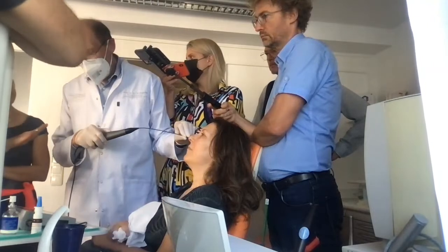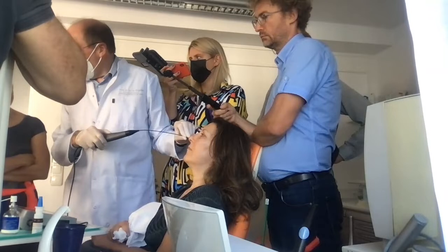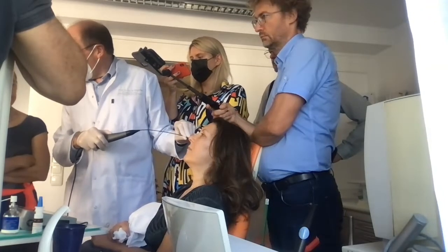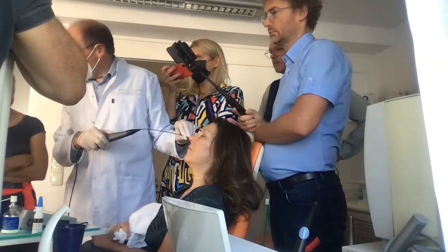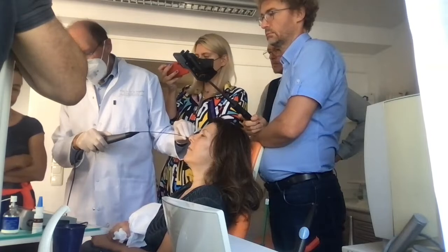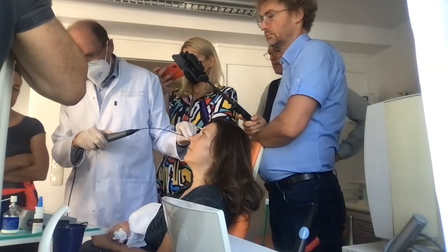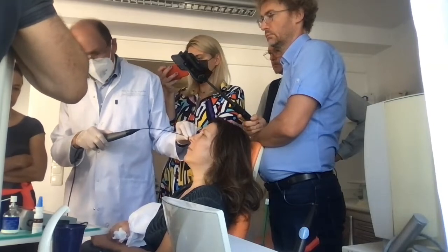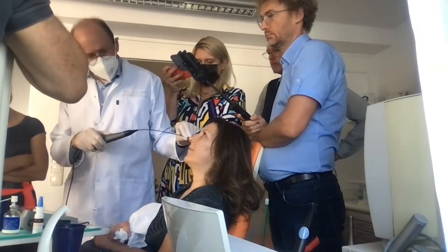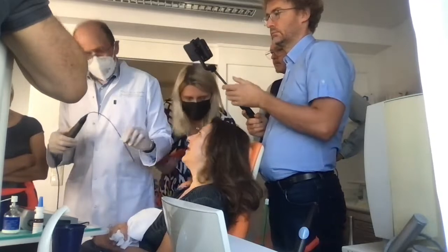Doctor, if she was lying back, would it be different? Of course. You want to move the chair back? The chair cannot be moved. Well, I would like to do it, but unfortunately, this chair is in vertical position. So this is important to have the vertical check. And now the horizontal check. Now we could move to another chair. But okay. Yes, we can. It's not possible.